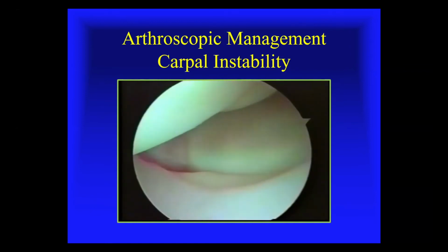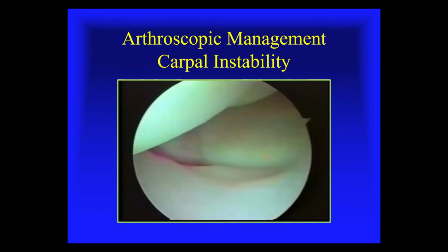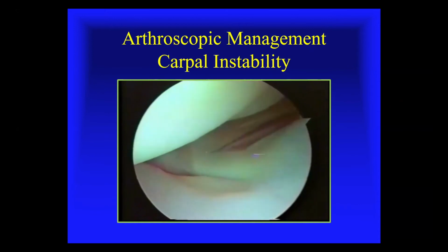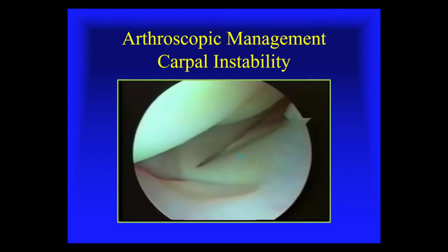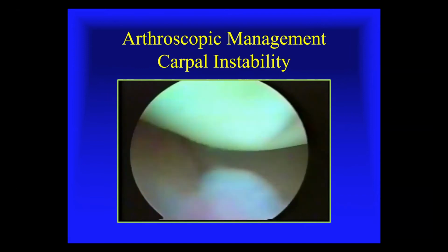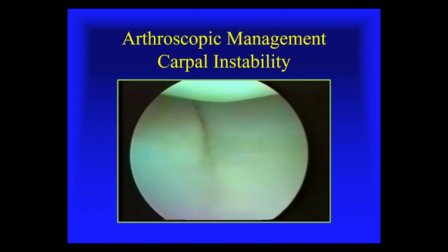When you look over at the triquetrum, there's normally about 1 millimeter of play. That's normal. Don't think that's an instability. So like Lee talked about, you need to go through both the radiocarpal and midcarpal space to look for instability. If you go to the radiocarpal space, there's no gapping. You go up, you may see a little bit of play, but that is a normal looking lunate triquetrum interval. Again, a nice tight interval between the scaphoid and lunate. That's normal.